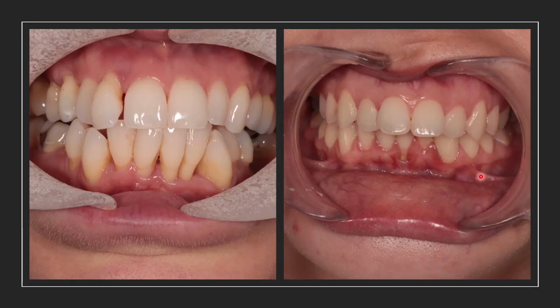Again, the case on the left-hand side. This relates to a slightly closer up image of what we saw earlier, just this gum issue. This is a lateral incisor that's just drifted out. That was the presenting complaint there. I'll show you the x-ray of that case in a second. The case on the right, we've got this pre-existing fenestration on the lower incisor there, at high risk for recession. So if you moved anything down there, there would be a high risk that fenestration became exacerbated.